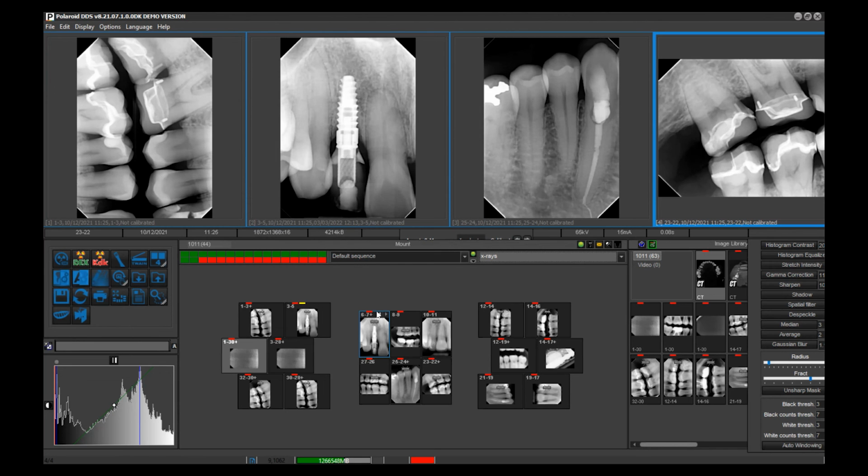Is there any upgrades at any point that we would need to do to the software? When you're on support, upgrades are free. Okay, got it. That's right. Actually, I remember that. I see that right now. Updates and support on that text. Okay. And Bob, I did tell her we would give her the data transfer. Okay. Just FYI. Not a problem.